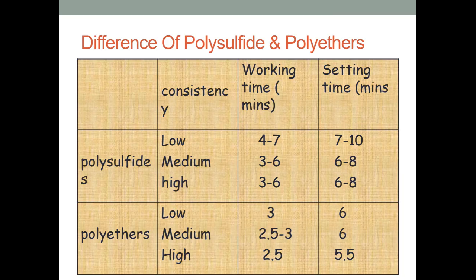These are the differences between polysulfide and polyether in relation to the consistency, the working time, and the setting time. Every consistency has a different working and setting time, as you can see in the slide.